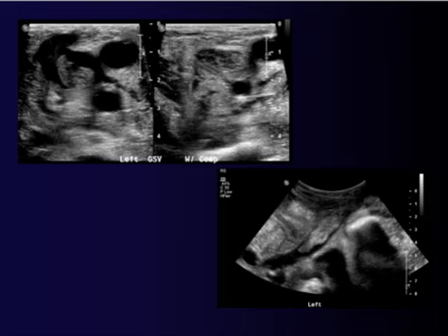and this was further evaluated centrally. You can see here's the greater saphenous vein coming in. We have a little bit more space around this thrombus, and as you can see here in the iliac veins, this vein is partially attached. We usually prefer our technologists to not compress in this situation because this type of thrombus is associated with a greater risk for detaching and embolizing.